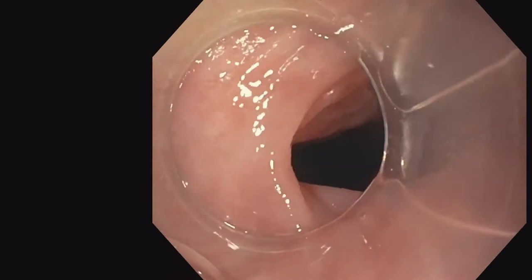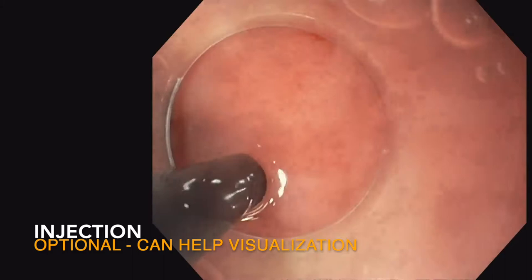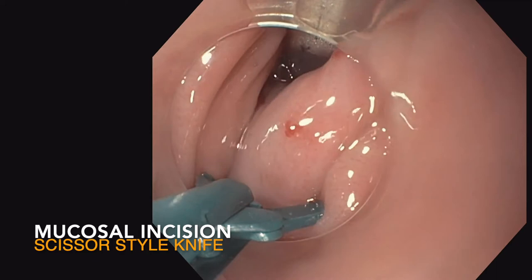My goal here is to take you through some of the key steps in endoscopic diverticulotomy. I often use a submucosal injection. The value of this is it can help with visualization as you dissect through the layers, including mucosa, submucosa, and then down into the cricopharyngeal muscle and beyond.